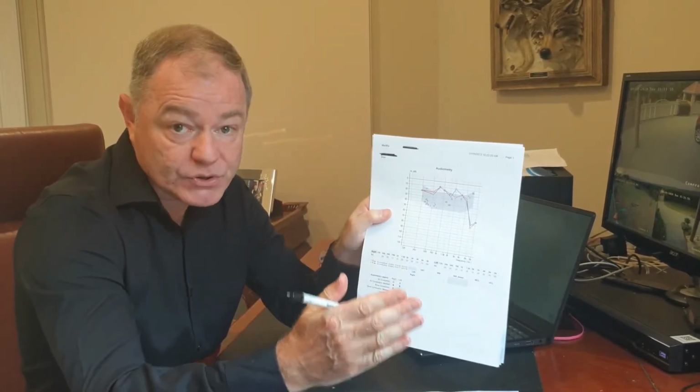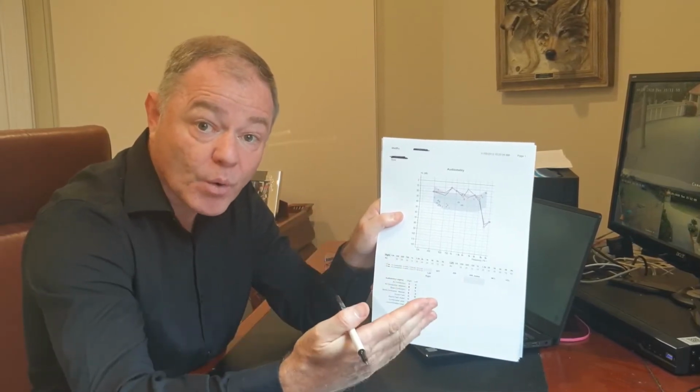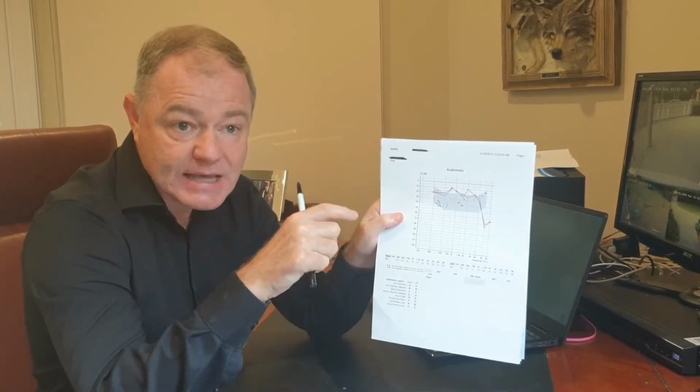Some people with a minor loss have a lot of troubles in communicating. Other people seem to make a little bit of information go a long way. So it's not everyone who needs correction. If this person was really struggling, then obviously it would be a good idea to trial a set of hearing aids on that person. However, if they were really experiencing no difficulties whatsoever, they were understanding pretty much everything that was being said, and they weren't turning their television up, then we wouldn't consider any need for a hearing aid.